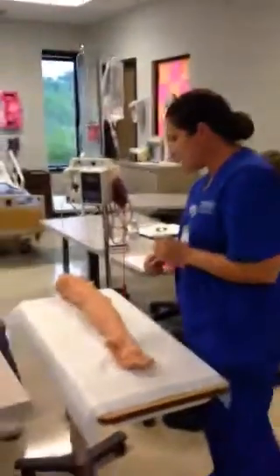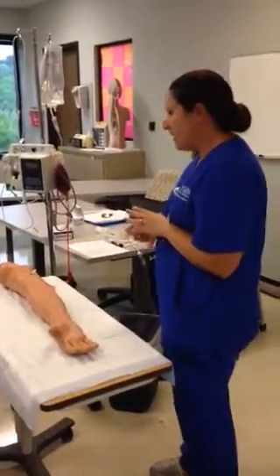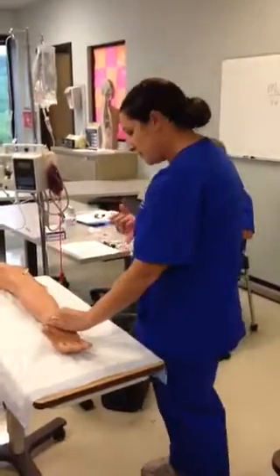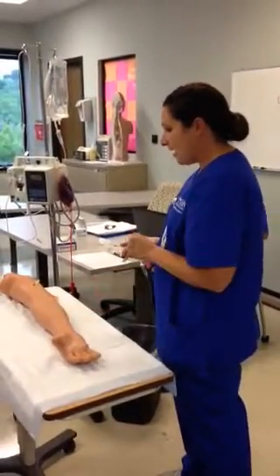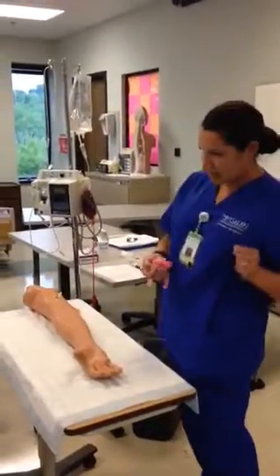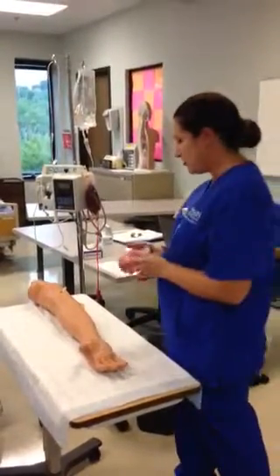Hi, Miss Pearl. My name's Kim. I'm going to be taking care of you today. The doctor's ordered for me to start an IV line and then also to give you a dose of antibiotics. Can you tell me your name and your birthday? Good. And do you have any allergies? No? Fantastic. Are you left or right-handed? I'm left-handed. Great. And is there any reason I can't use your right arm to start your IV? No? Okay, great.